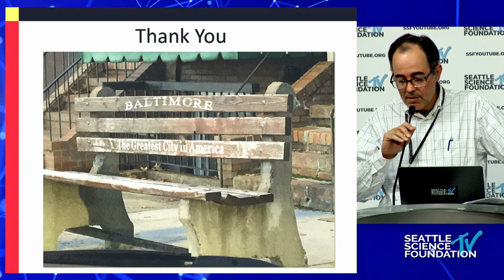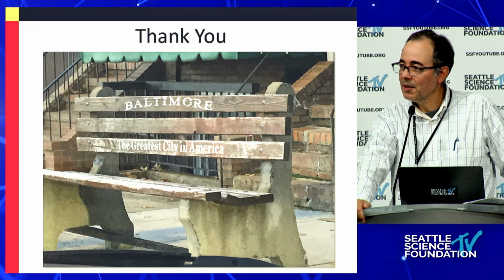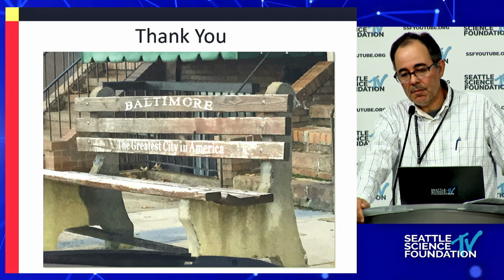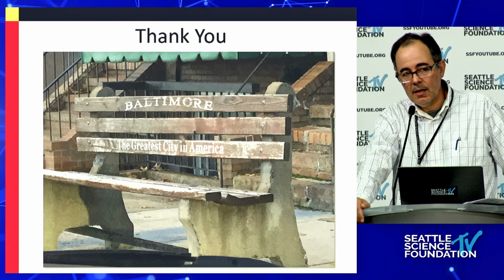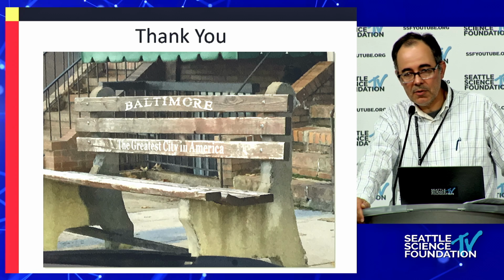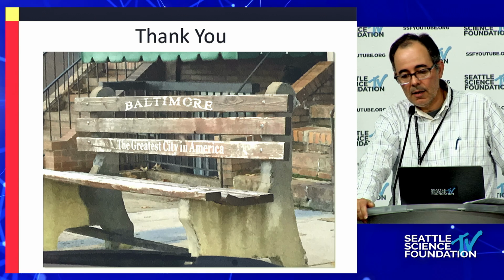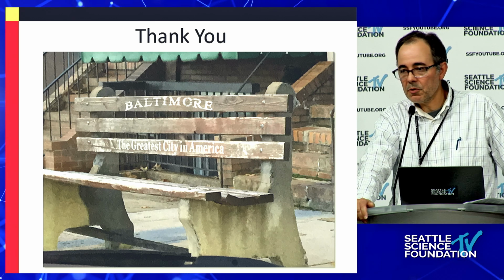I think it's a combination of things, but like everything in life, it's multifactorial. Certainly one consideration is the finances, but I think the second consideration is the speed of the surgery. An arthroplasty is a more demanding procedure. It requires very good precision to be perfectly midline, very good fluoroscopy. You're making these keel cuts very often. There are a few extra steps there.